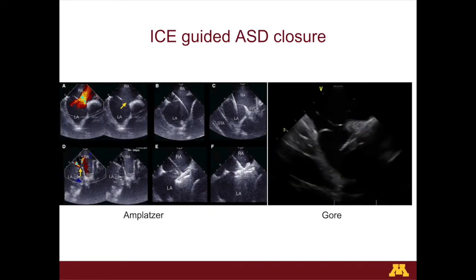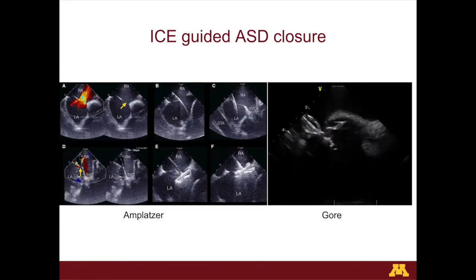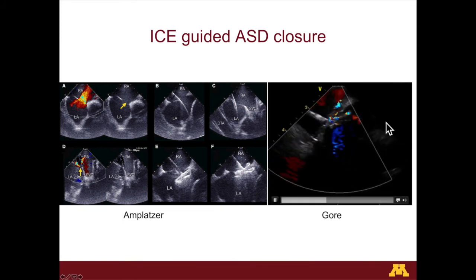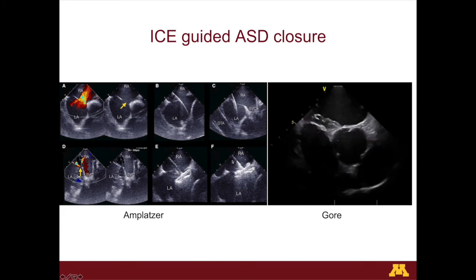Similarly, ICE can be very useful in ASD closures as well. Everything is similar. Whether it be an Amplatzer device or a Gore device, ICE can give us beautiful images as shown here.